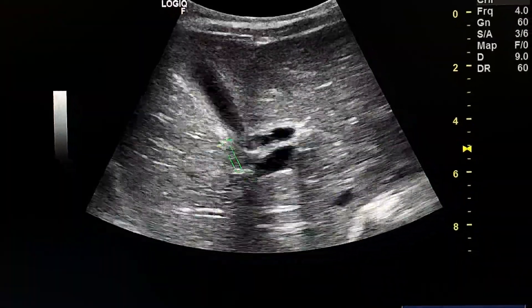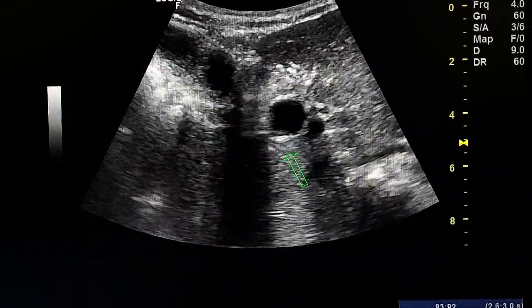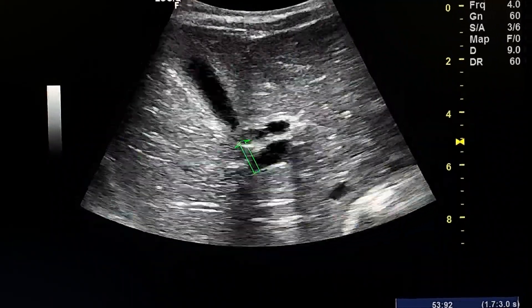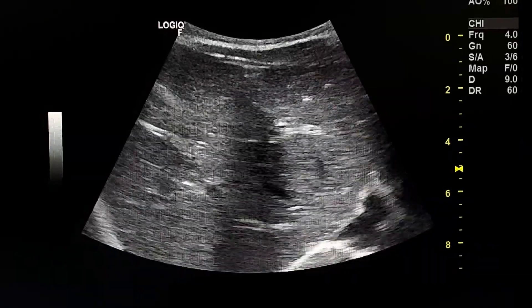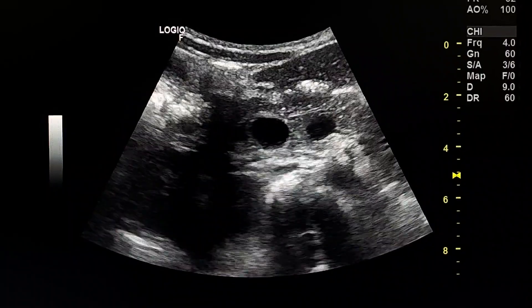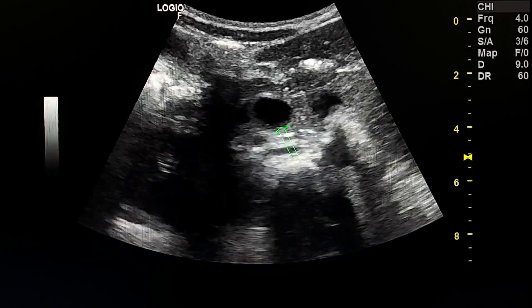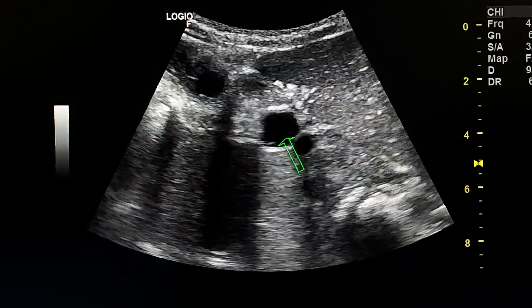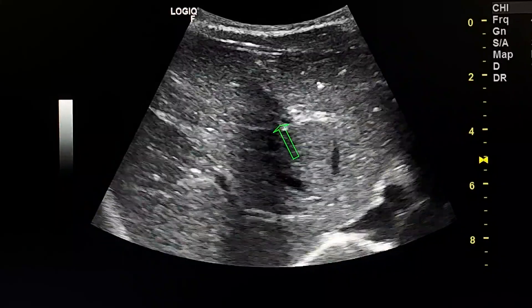This is the gallbladder, this is the common hepatic duct, and this is the portal vein. We see dilatation of the common hepatic duct, which measures 14 millimeters. The dilatation is in the common hepatic duct and common bile duct from the liver to the pancreas.